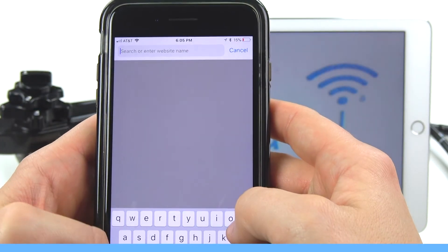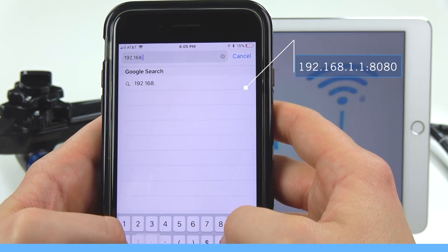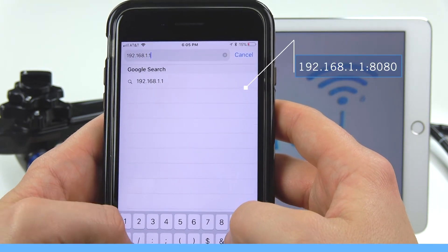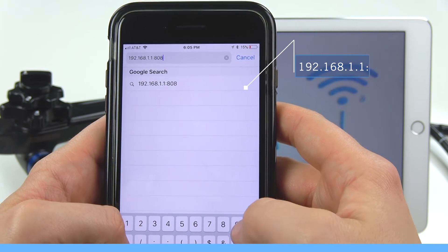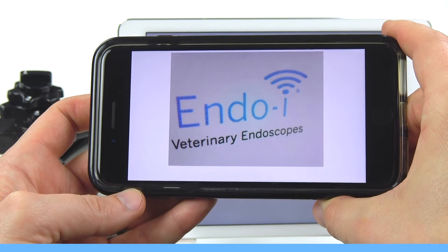You can also view the procedure in a browser like Safari. On a tablet or phone, launch the internet browser and type in the following IP address: 192.168.1.1:8080.